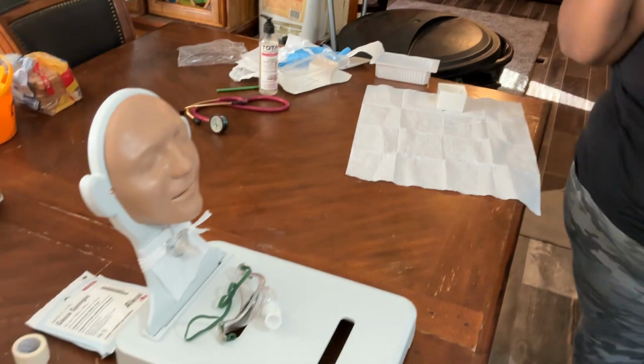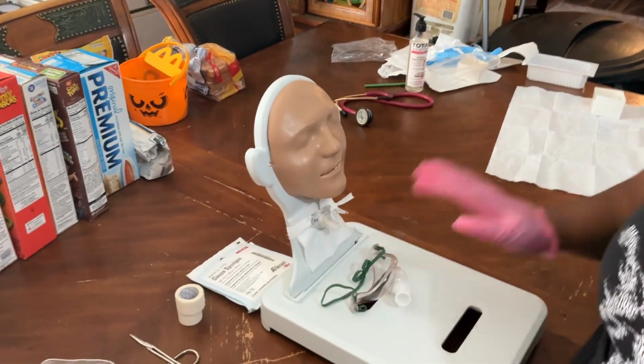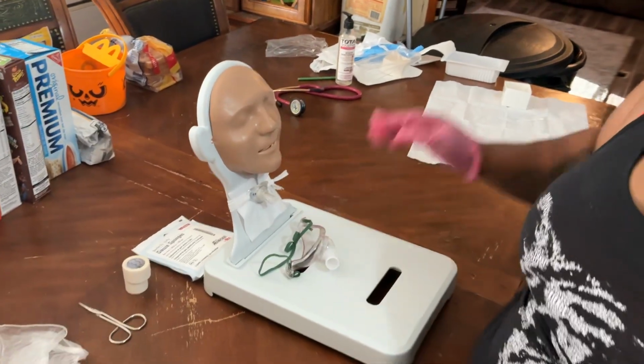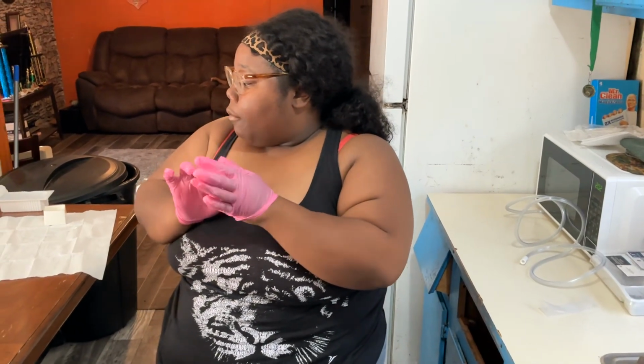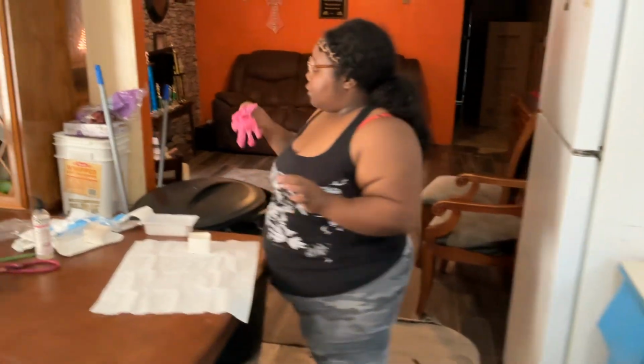Alright. I will assess my patient. No signs of respiratory distress. My patient isn't in any type of distress. So now I'm going to go ahead and turn my patient's oxygen dial back down to the oxygen level that was ordered for that patient. I've already turned my suction catheter off. I'm going to remove my gloves.